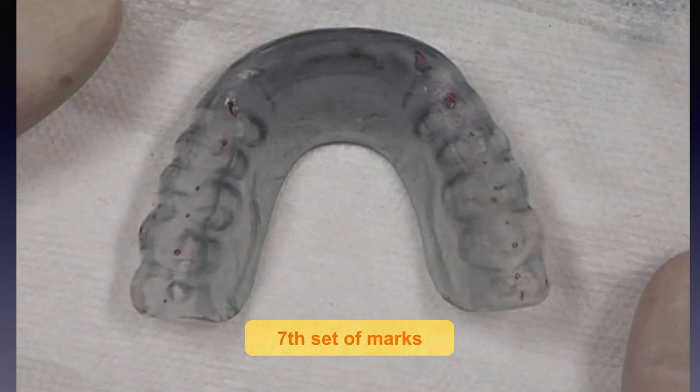Completing the tune-up for this orthotic involves adjusting the protrusive and lateral protrusive incisive pathways, but that is the subject for the 5th and last video of this series, so will not be included here.